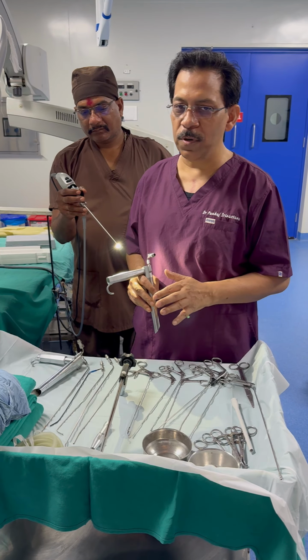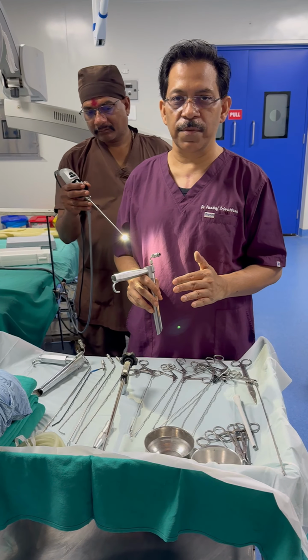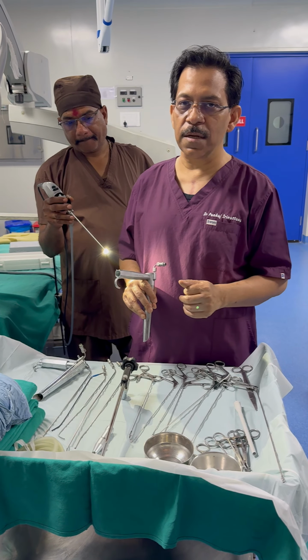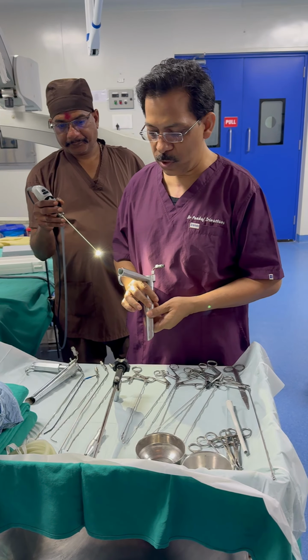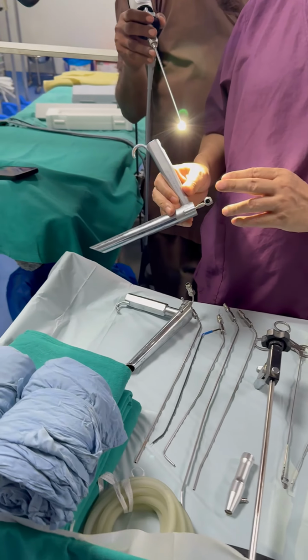So before general anesthesia, it is not easy to define that this patient will have a problem in seeing anterior commissure or operating anterior commissure. So what are the options? Now we have two types of laryngoscope. Everyone has this other type.